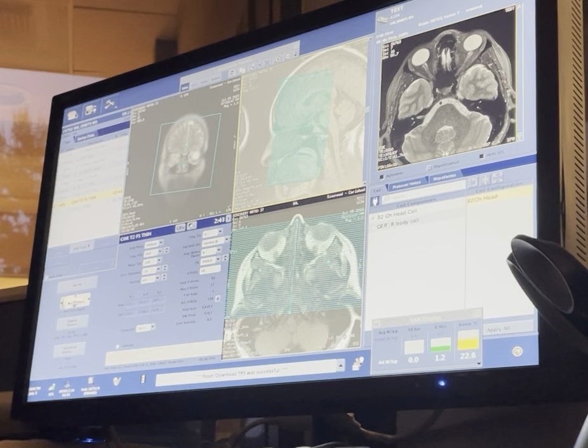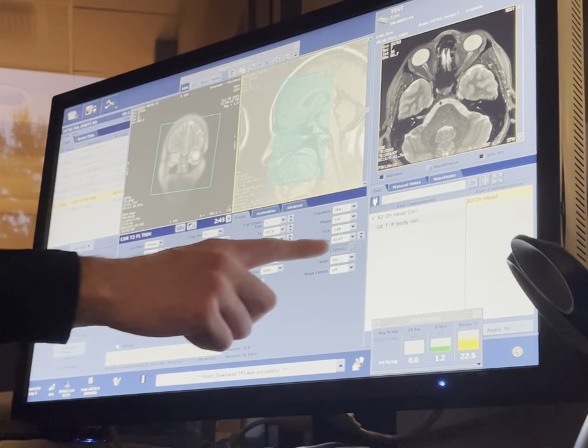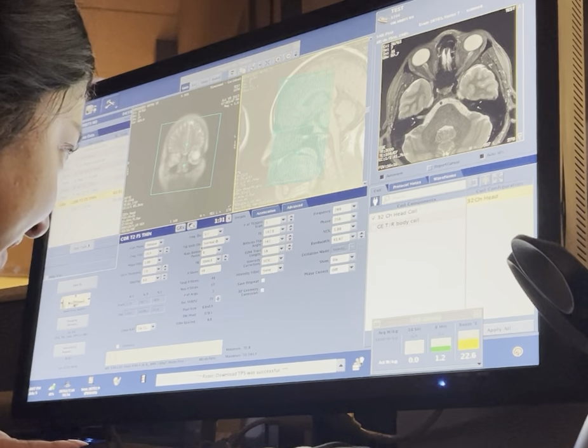Yeah. All right, now click this. Let's go to one next. Tell her this one will be a minute and a half and do the same thing. Okay. Hey, this next one's a minute and 30 seconds, okay?